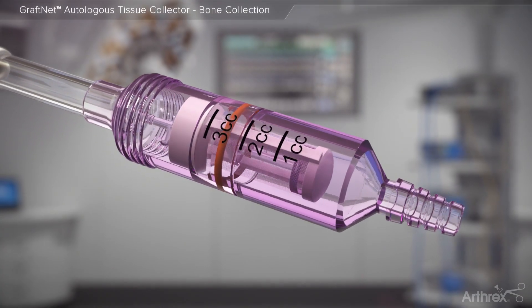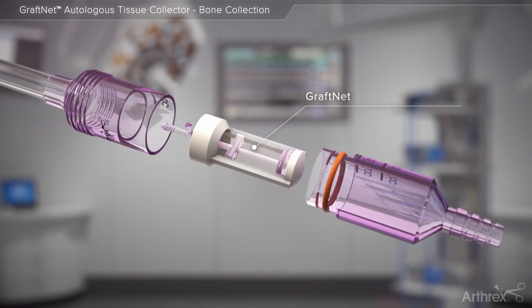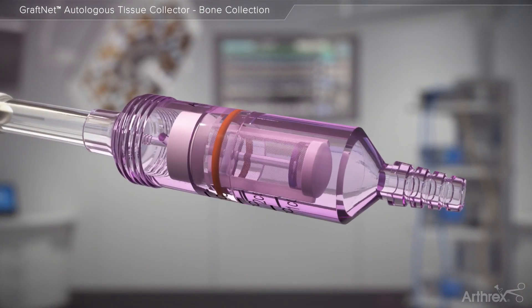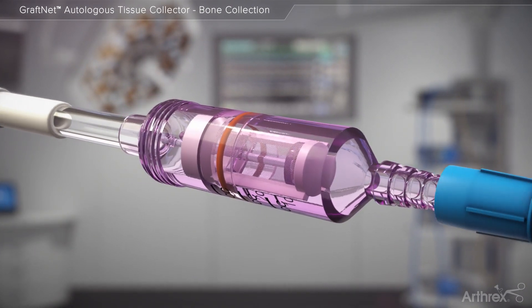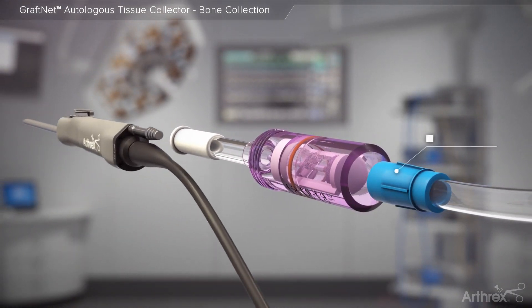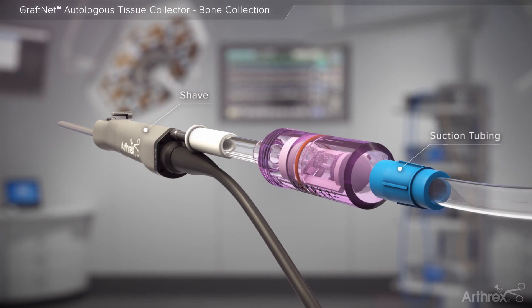The suction-activated GrafNet device is designed to collect autologous tissue for a multitude of applications. When connected inline to suction and an arthroscopic shaver, the GrafNet may be used to collect particulated autologous tissue into a sterile filter chamber.